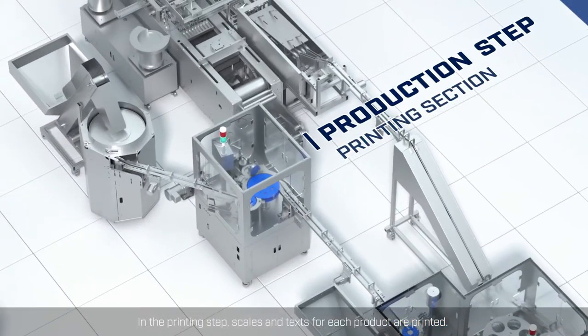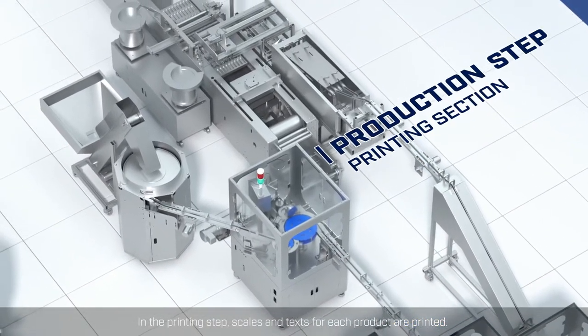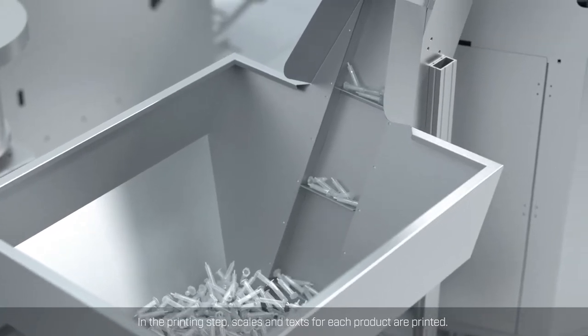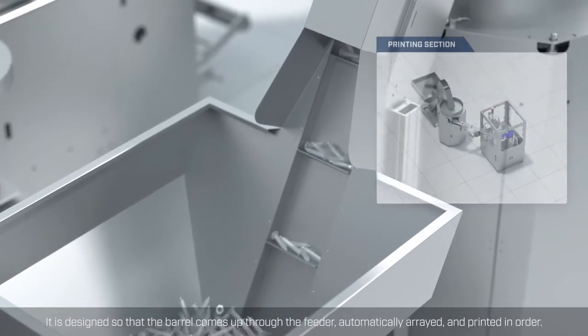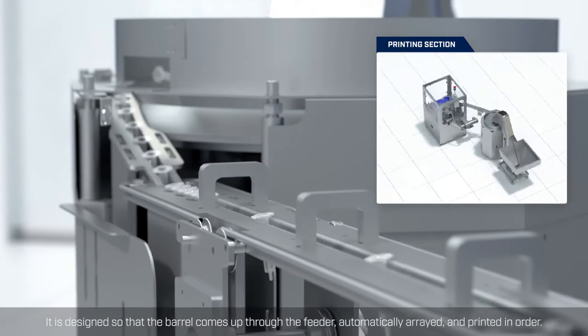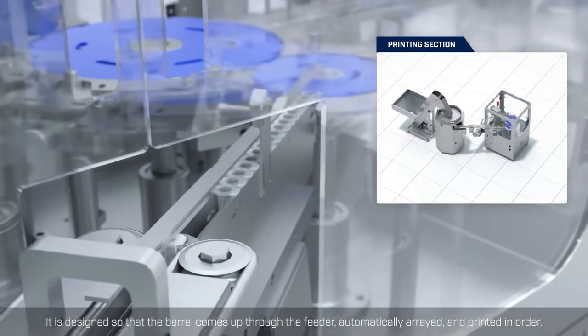In the printing step, scales and texts for each product are printed. It is designed so the barrel comes up through the feeder, automatically arrayed, and printed in order.